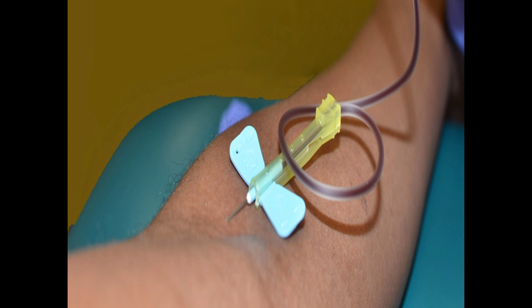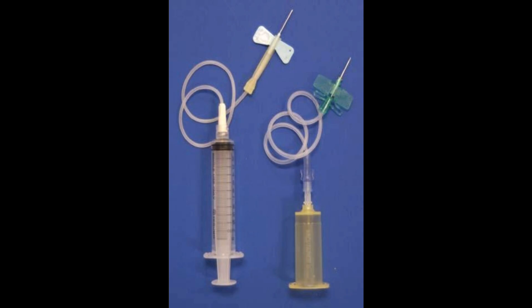And there you have it. The picture shown on the screen is a butterfly or the winged infusion system attached to the body of the syringe — you can also do that. While on the right side is the winged infusion set attached to a tube holder. Either of these two techniques can be used during your venipuncture procedure, but make sure the technique is done correctly to avoid hemolysis and clots.